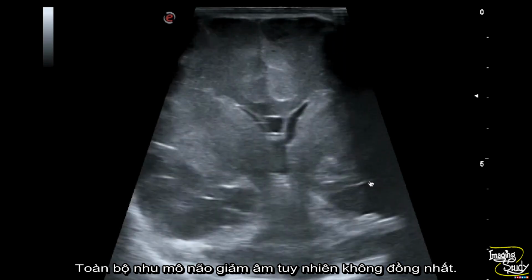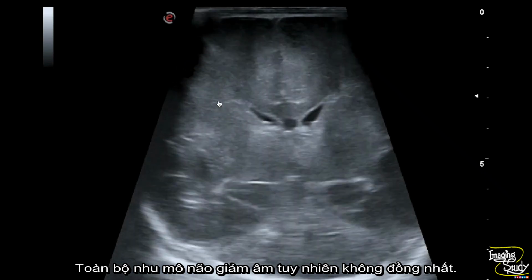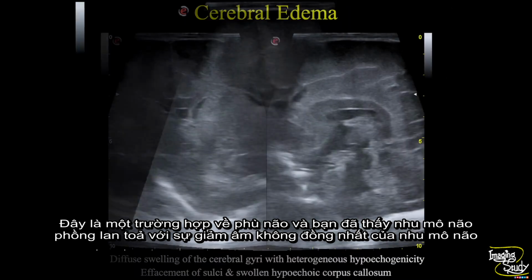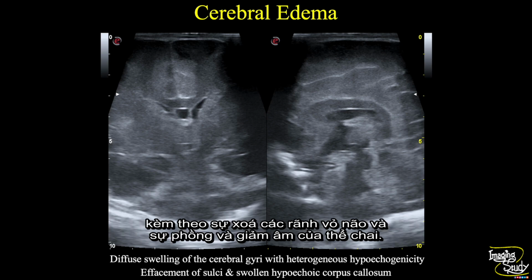Overall periventricular echogenicity is increased, but the brain parenchyma is heterogeneously hypoechoic. So this is nothing but a case of cerebral edema, where you have seen diffuse swelling of the cerebral gyri with heterogeneous hypoechogenicity of the brain parenchyma with effacement of sulci and swollen hypoechoic corpus callosum.